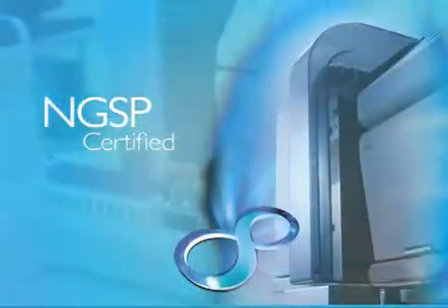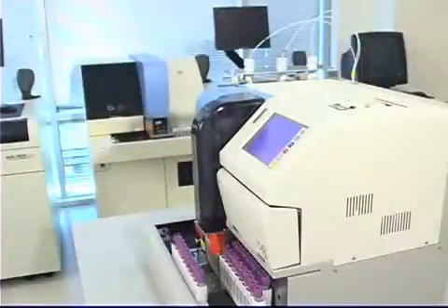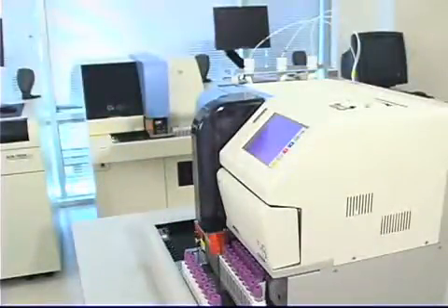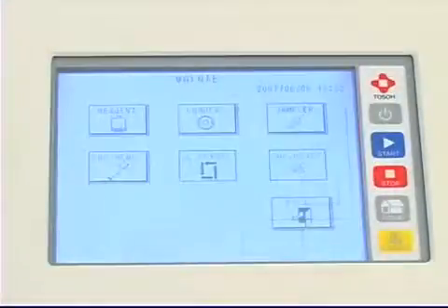The small footprint and simple operation of the G8 make it a perfect fit for any laboratory. The entire system uses less than 2 feet of counter space, and all functions are performed with easy-to-use touch-screen operation.